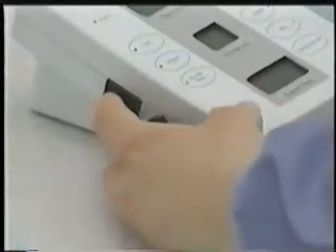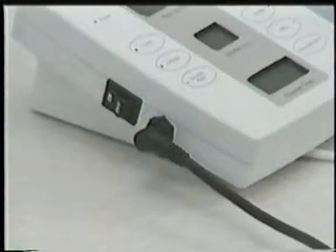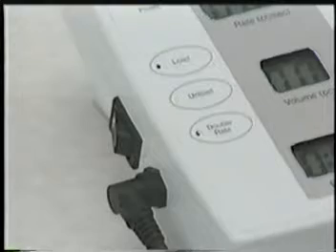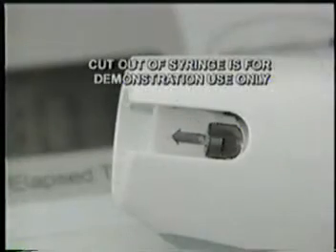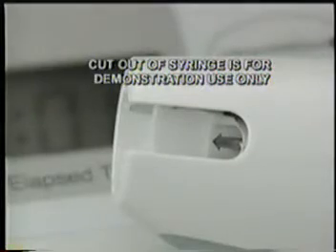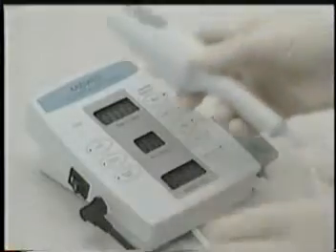Turn on the CCS by pressing the rocker switch located on the left side to the on position. If the unload light is blinking, simply press the unload button once. This will return the plunger in the handpiece to the home position. It is this easy to prepare your Comfort Control syringe for use.